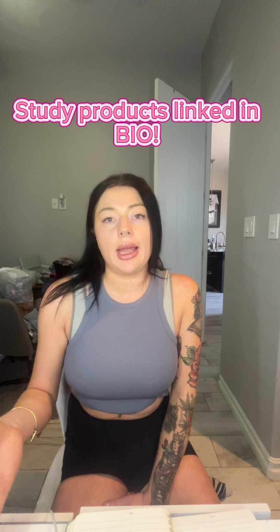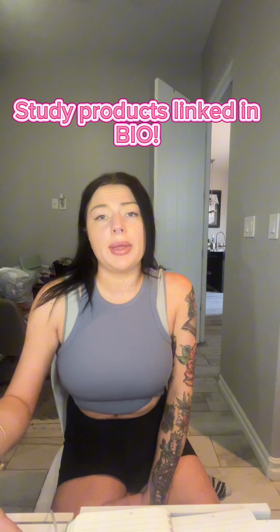IE ratio, breath cycle time, and I time are important to ensure oxygenation and ventilation. Your patients do need more I time, and that's okay. Obviously, we've talked about it, but you need to make sure that they are exhaling. And if they're not, is this benefiting them better than what they were doing? Because if not, then we need to change something. You need to play with the vent. You need to play with something to fix the problems that they are having.